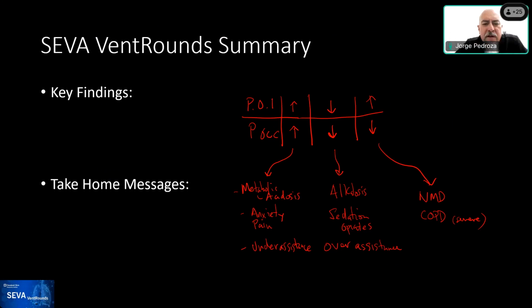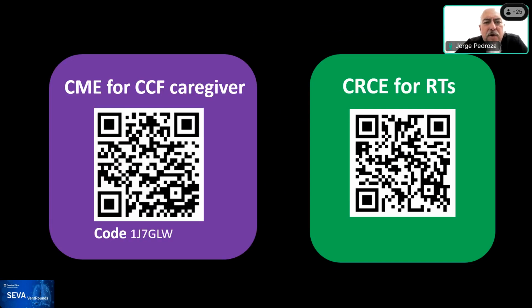Well, I think that in this kind of patients, we should always focus on the goal we have in ventilation, and also, if possible, we should try to measure the respiratory drive and effort. Also, as Ariel says in his last chat message, we should use a lot of clinical judgment, not only watching the curves, because if the patient has a lot of sedation or has neuromuscular disease, it might help us take decisions according to the goal. So that's what I would take home.